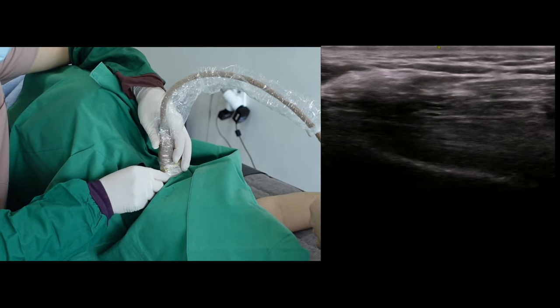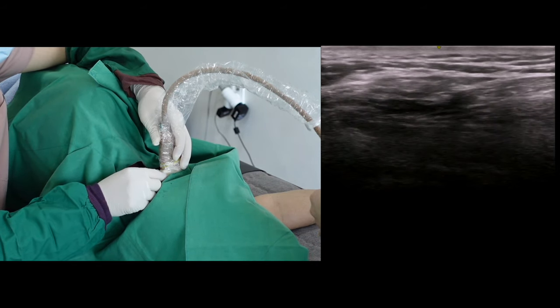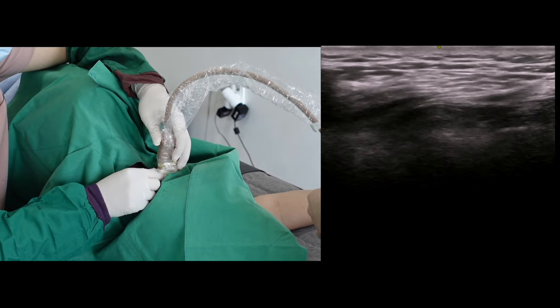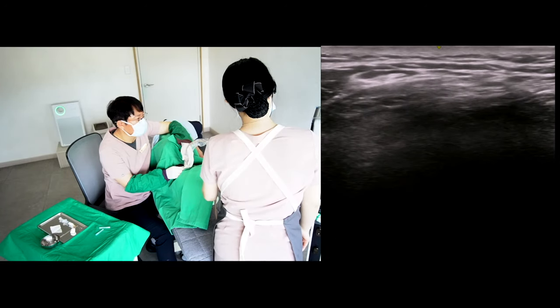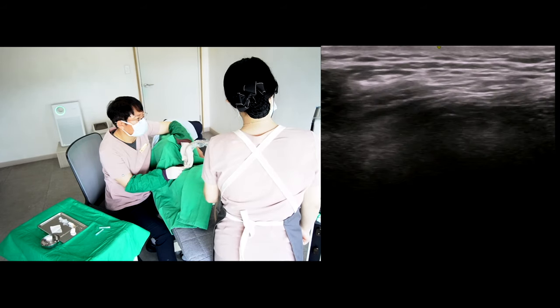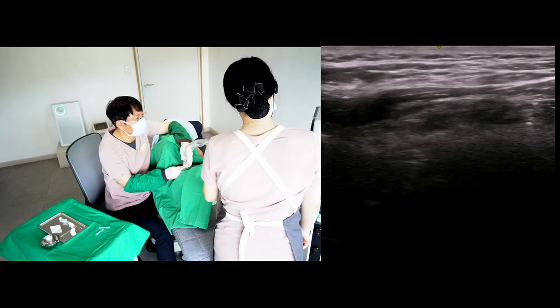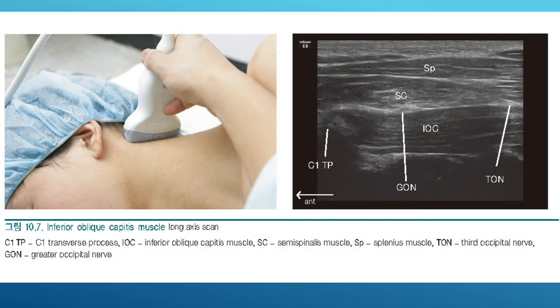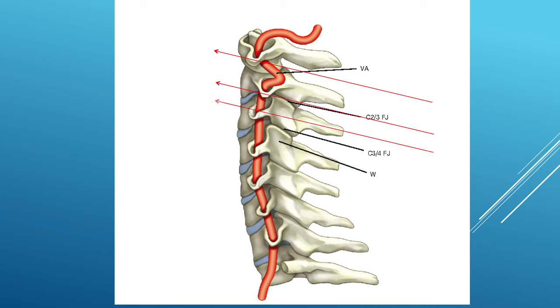I spend a lot of time on pre-scanning. The scanning initiates from the oblique scanning of the inferior oblique capitis muscle and counts down to the lower cervical spine. After identifying the inferior oblique capitis muscle, I slide the probe down parallel to that muscle. This shows the orientation of the probe and the scanning sequence.